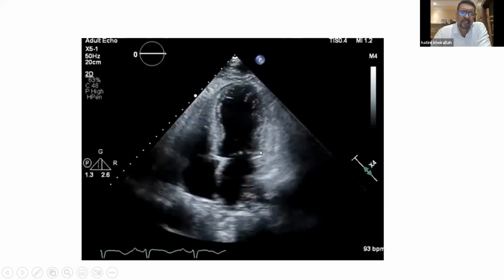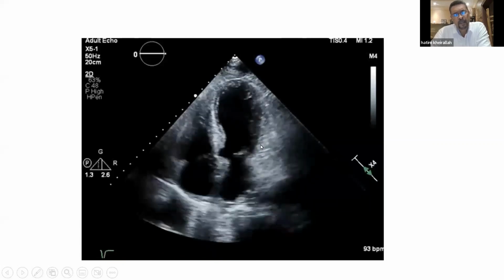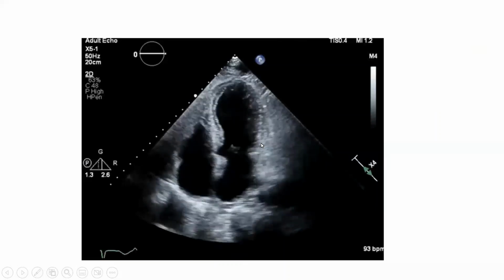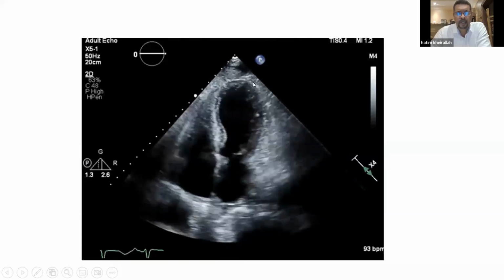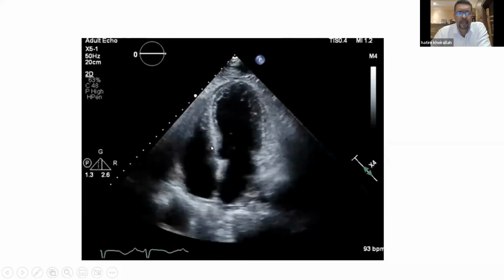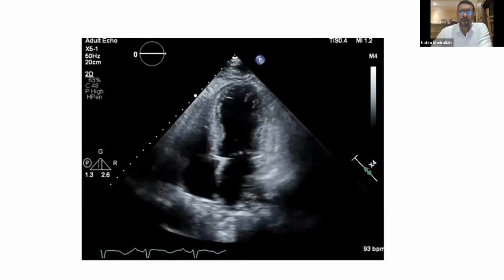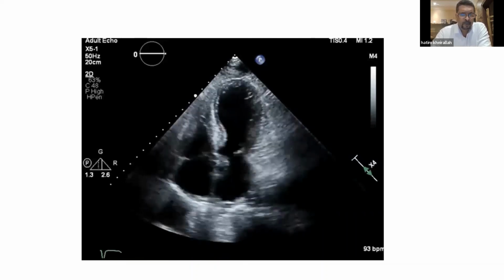And does this remind you or ring any kind of diagnosis in your mind? Anterior myocardial infarction. Okay, anterior myocardial infarction, one diagnosis. Second possibility? Takotsubo. Exactly. But if you consider Takotsubo, I think you shouldn't stop at the diagnosis of Takotsubo.